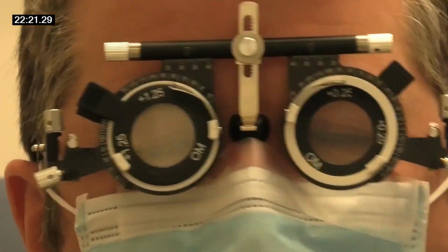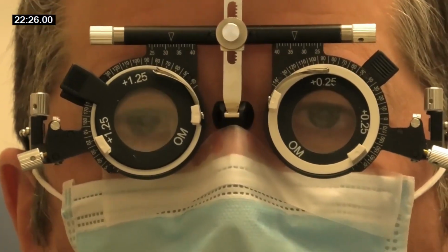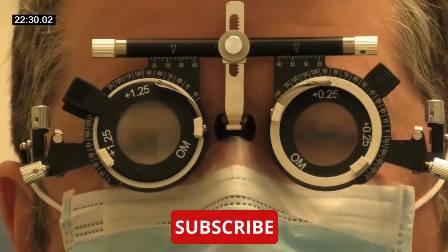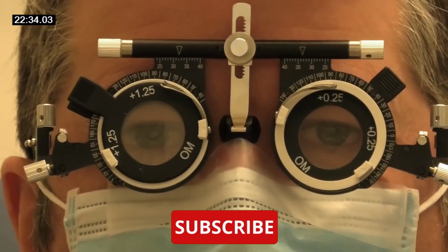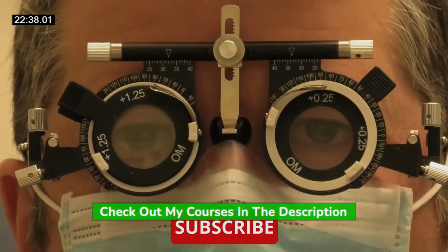Probably slightly worse. There's not a lot in it. Slightly worse. Yeah. So no more plus. Okay. So should we go for the red and green now? Why not? Including binocular. Do that at the end. Okay. Yeah, we're still in the balancing phase. Yeah. The binocular addition, that's right. Okay. Once we've made sure that they're even, which probably are. Yeah.